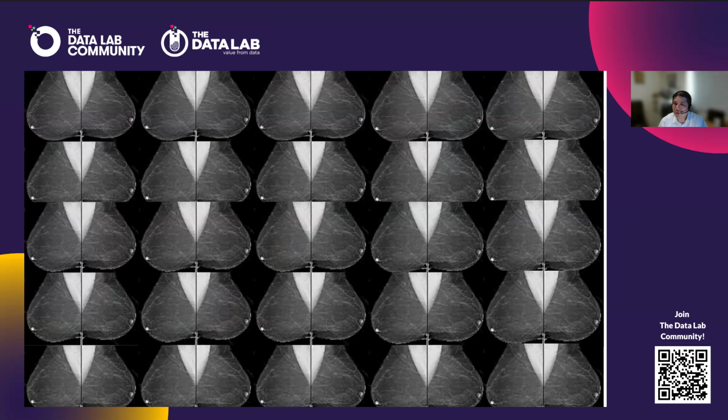That's 2 times 2, 4 million reads. And within these 4 million mammograms that we're reading, those cancers could be anywhere. They could be spread out anywhere in that pile of mammograms. An average reader has 1 session a week, which is like myself, and we would read 5,000 mammograms. How many cancers do you think are in those 5,000 mammograms for a screening population?